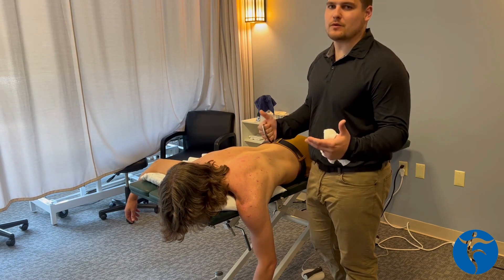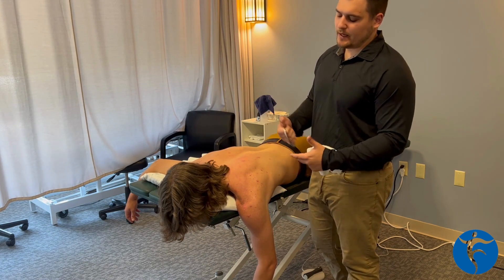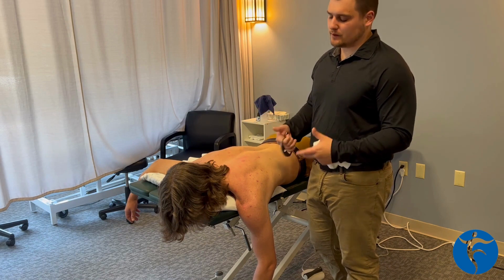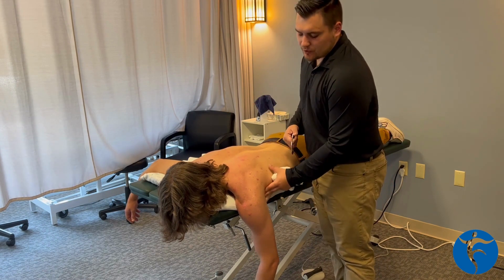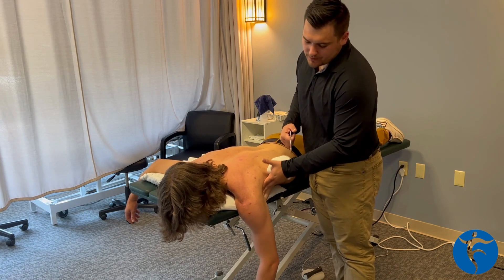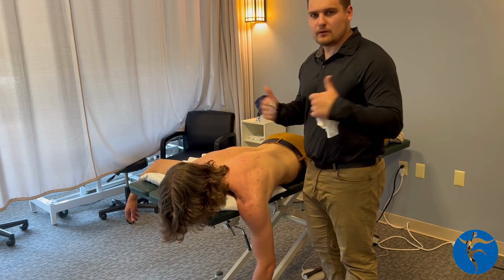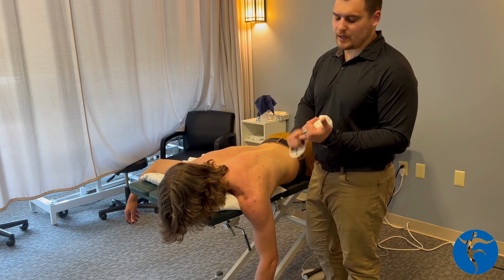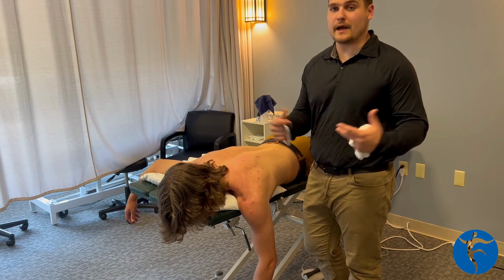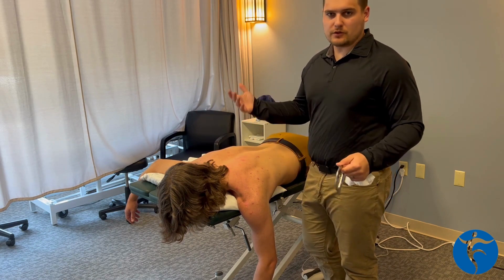I think it's important, especially with overhead athletes, any throwers. I work with a ton of shoulders. More often than not, I see that the lat is very tight, which adds some restriction in the posterior cuff region. We can use a various amount of methods to get rid of this tightness, from dry needling to soft tissue mobilization to exercise in general. You can also use your hands.